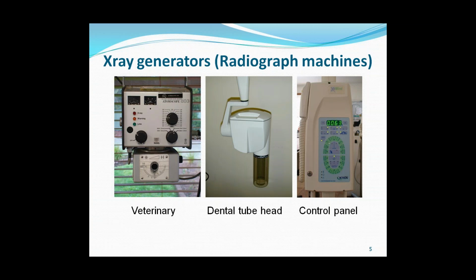On a lot of the newer X-ray generators, they actually have algorithms within the machine. So you'd need to choose the animal and the tooth if you're going to take a particular area of the mouth. For example, on the right-hand side here, you can see there's a circle on the panel which represents the open mouth view.